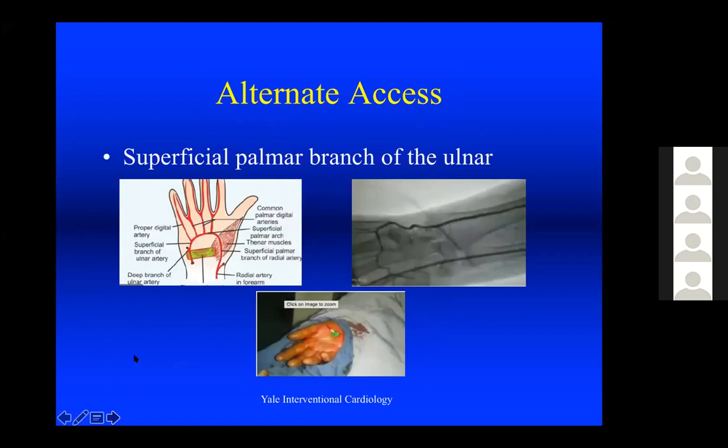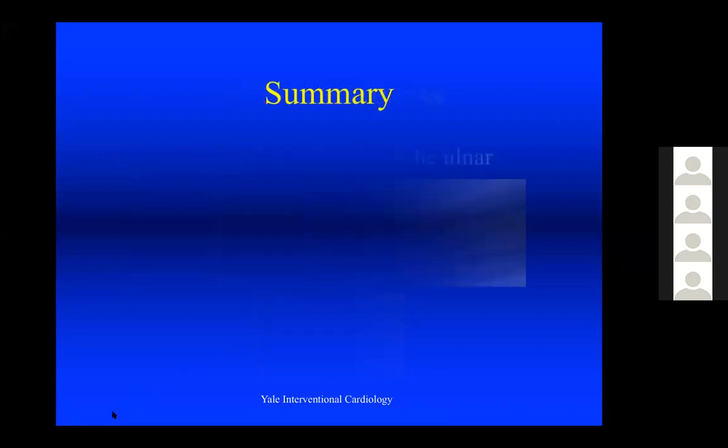And then there's other kind of crazy access. This is a paper describing accessing the superficial palmar branch of the artery here in the hand, which looks really crazy to me, very uncomfortable, but I guess it's possible. I think that's my last slide.